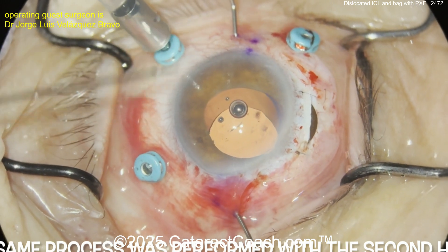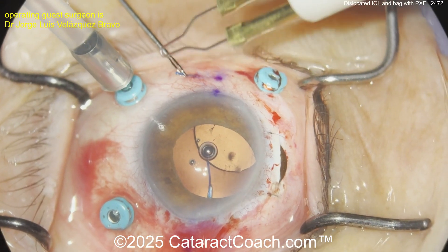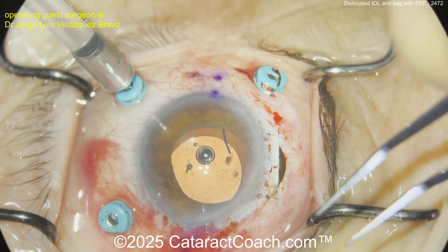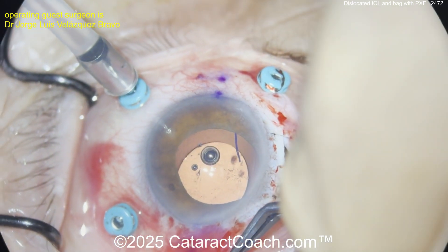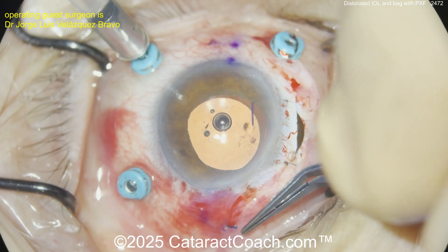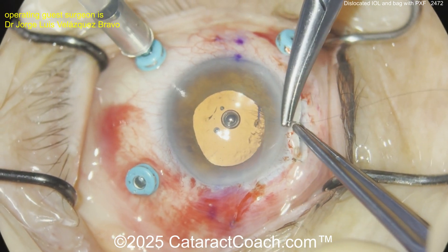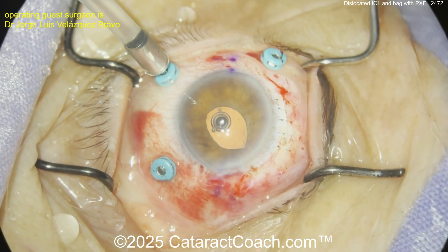Pull, pull, pull — nice and gentle; you don't want to break these haptics. Once you grab onto that haptic, do a little bit of cautery. Remember, don't just leave the nubbin of the flange under the conjunctiva — you want to bury them within the sclera for better long-term stability. Do the same on the other side with a little bit of cautery. There's a little bit of iris prolapse, so put some sutures in to seal up that incision. Get that flange buried within the sclera, iris back inside the eye, maybe put some Miochol too. Now finishing up suturing that incision — what a nice outcome.